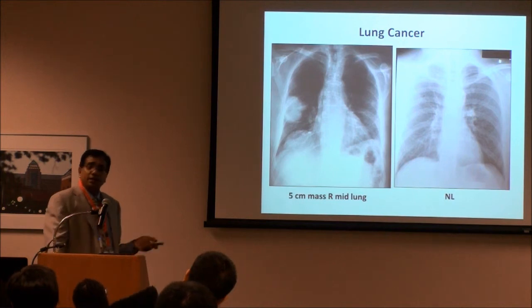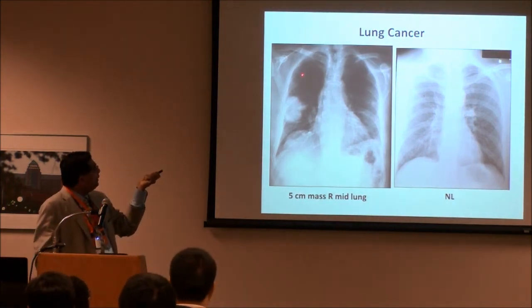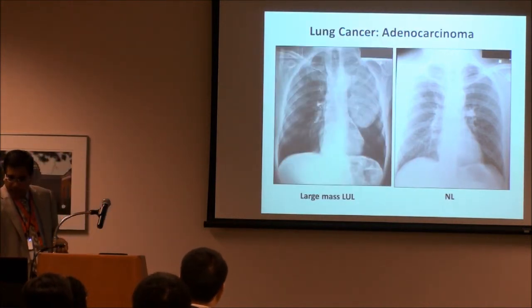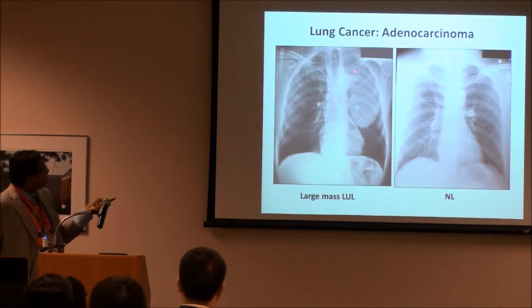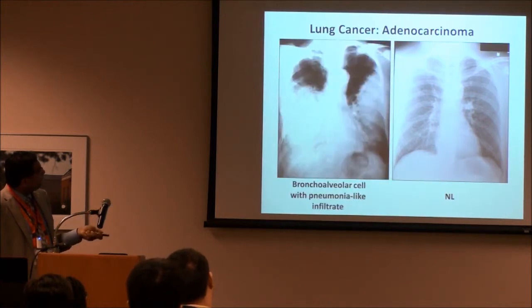Okay? Not all lung cancers are so easy to diagnose. Some of them are really, really small and tiny. So this is another cancer here. You see this cancer, how big it is? It's a huge cancer, all this white area here. So this again, look at that.